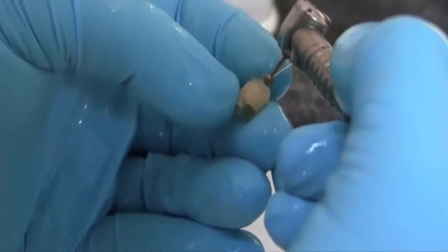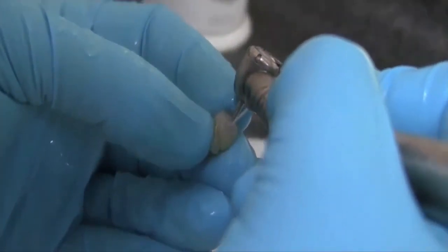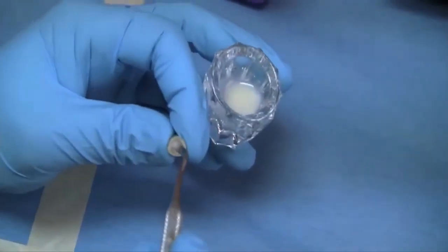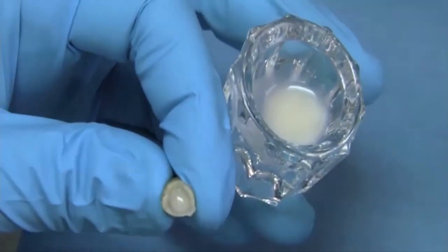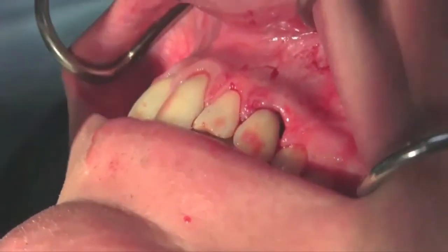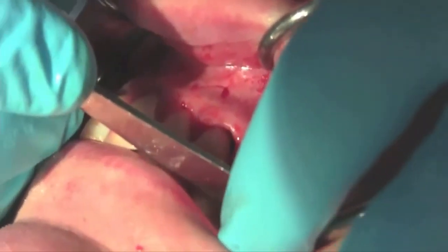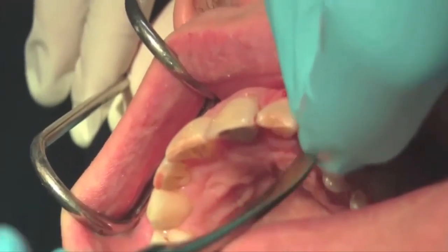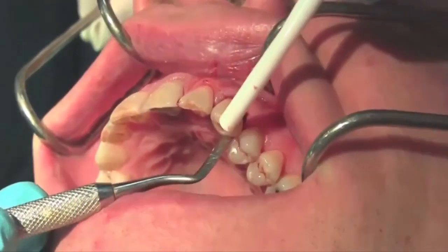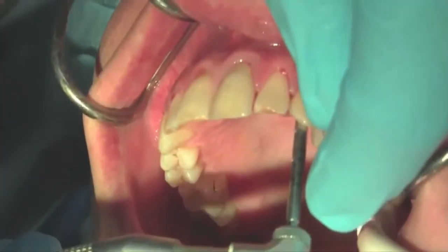We proceed to open a perforation between the incisal edge and the cingulum, because we need to have some access, since it's going to be a screw-retained temporary restoration. We take it back into place and we index the abutment, and the acrylic is going to create retention and a connection between the abutment and the crown.